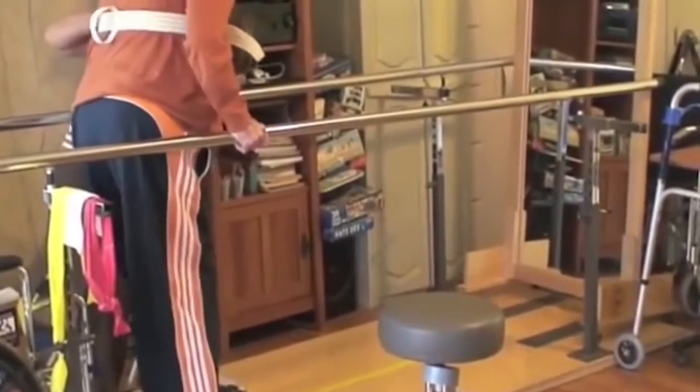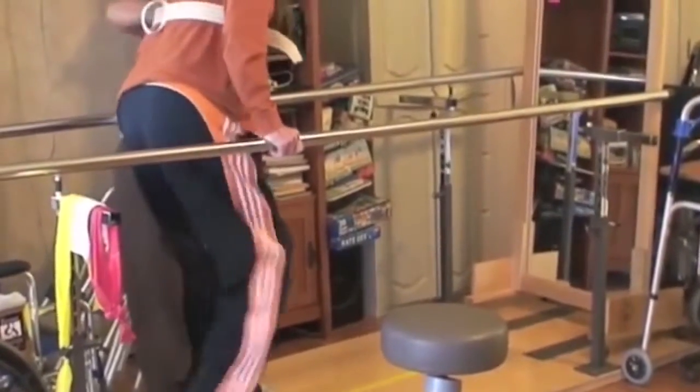Many physical therapists, particularly in the orthopedic outpatient setting, have at their disposal equipment such as stationary bikes, treadmills, elliptical machines, and various weight equipment. When you go into the inpatient setting — whether it be subacute units in the hospital, skilled nursing, or anywhere patients are treated — they may not have the functional abilities that someone in the outpatient setting would have.